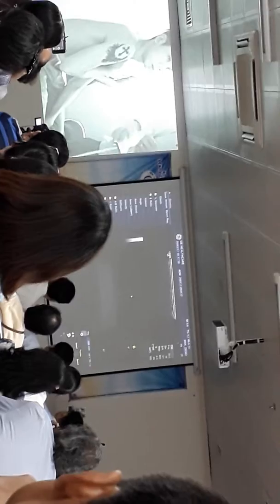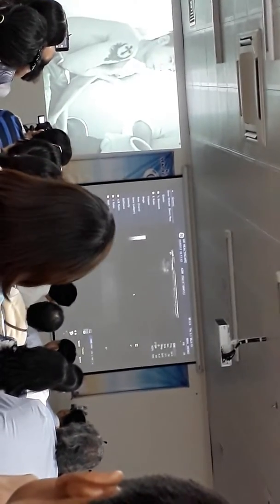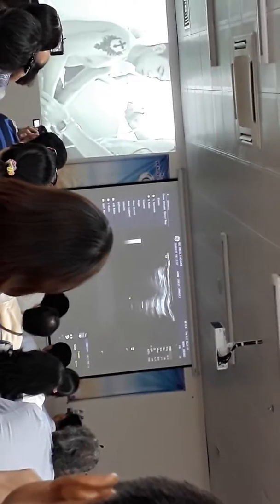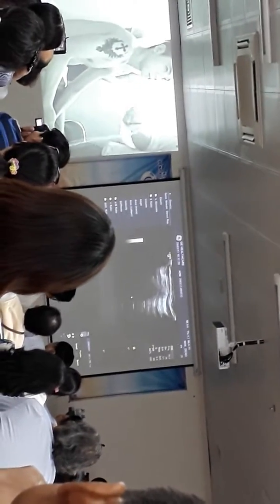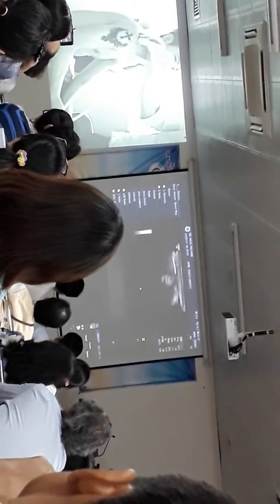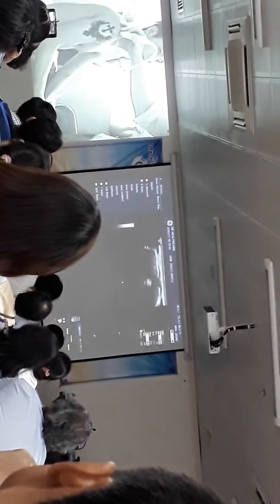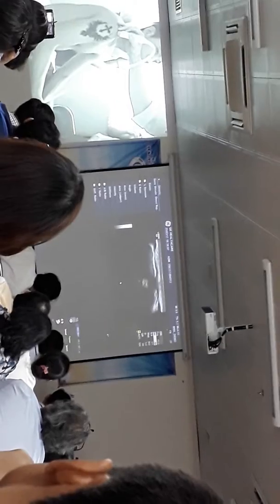From there, I'll have a look at the patient's AC joint. So just get the patient to pop their hand on their hip again. We need to move our focus up. We need to move our frequency up.